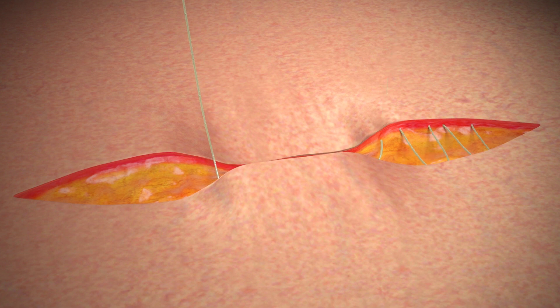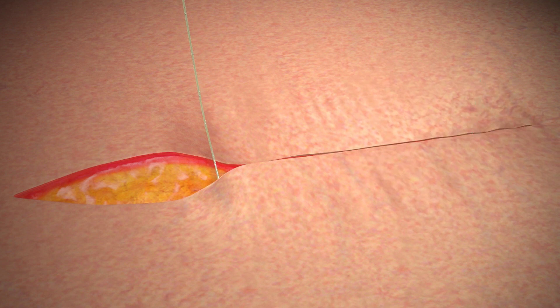To complete a subcuticular closure, take at least one pass in the reverse direction, then pass the needle across the incision and take a split thickness bite perpendicular to the incision and exit the skin.